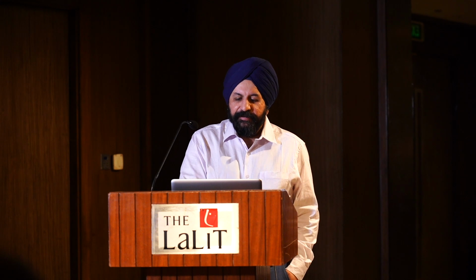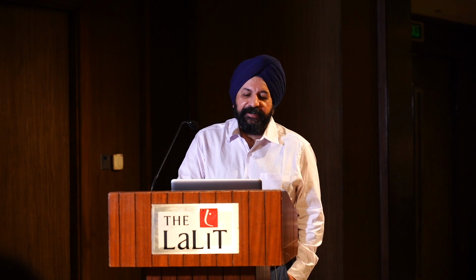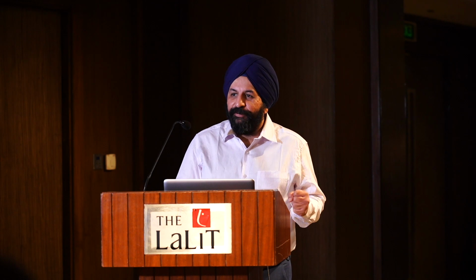Next we have the immunoplatelets, which are nothing but CD61 tagged platelets, which is the closest you can get to the gold standard, which is fluorescent flow cytometry. But in an era where most players are giving full body checkups at 499, if I sell a platelet count at 2000, both Kejriwal and Modi will be gunning down my lab to close it down.